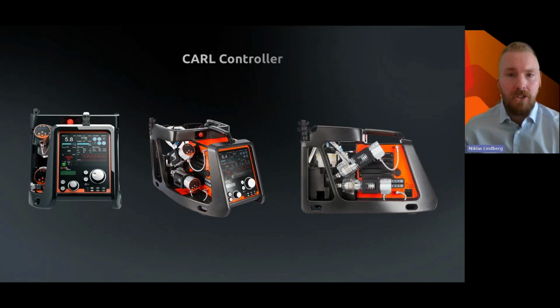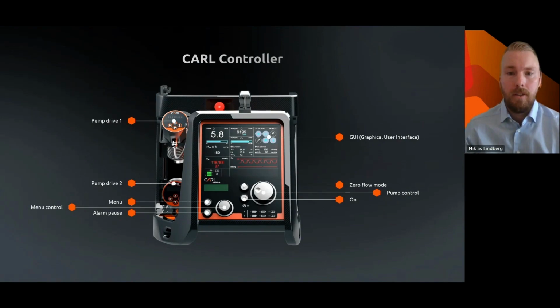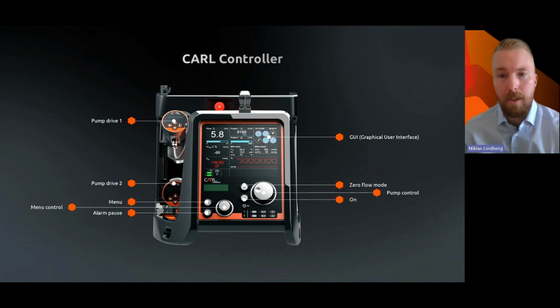Here are just some pictures of the controller itself. You see the dual pump on the left-hand side, and you have a nice, quite large interface for controlling the patients. Just an overview, and you see the pressure curve applied by the fiber optic cable in the middle. It's very similar to an IABP.